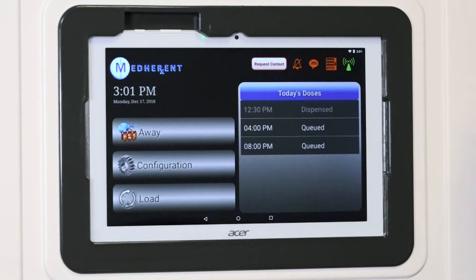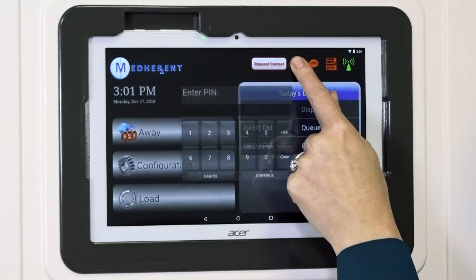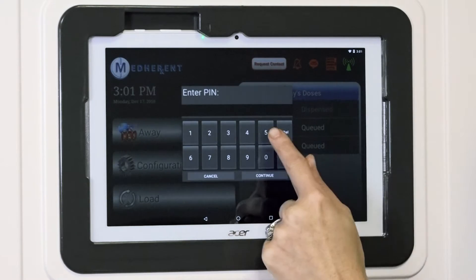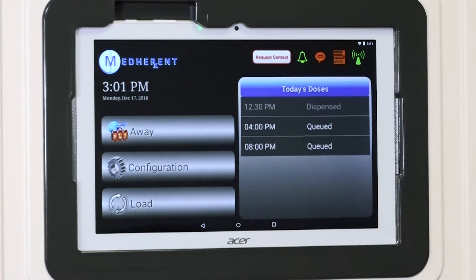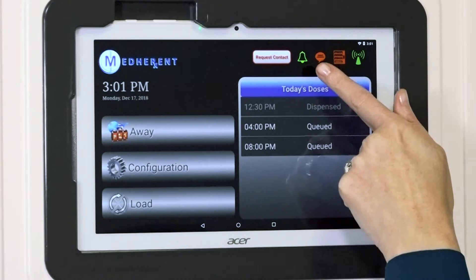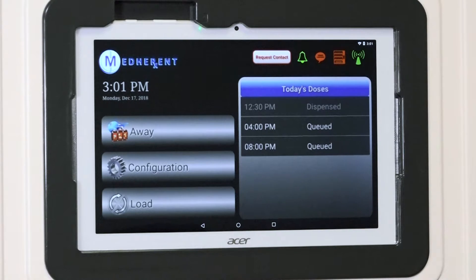If you would like to turn the alarm back on, simply press and hold the icon, enter the administrative pin, hit continue, and the alarm will be activated. The icon is now green.